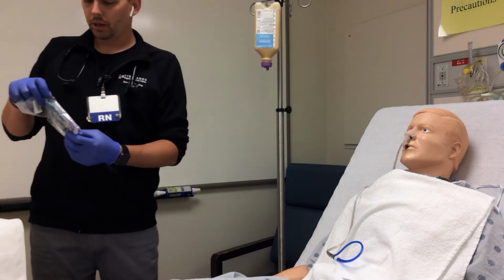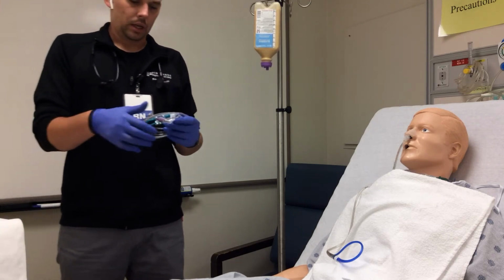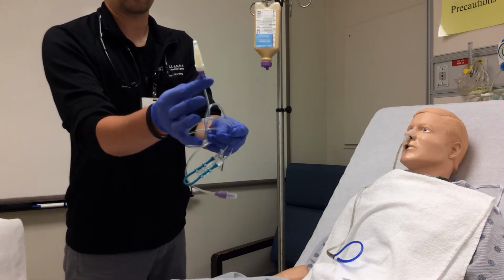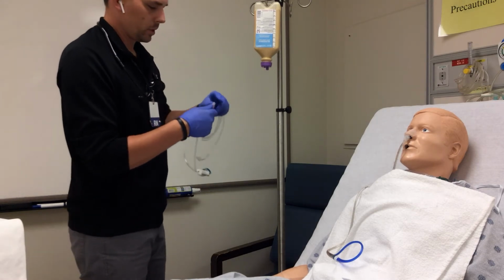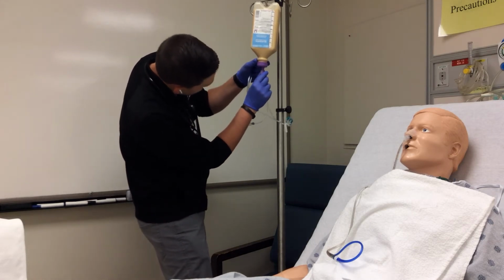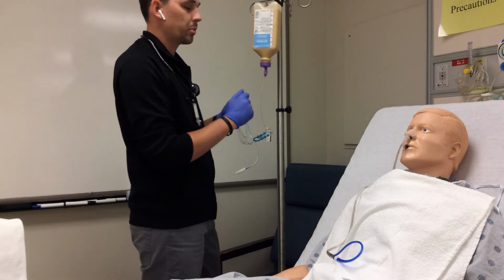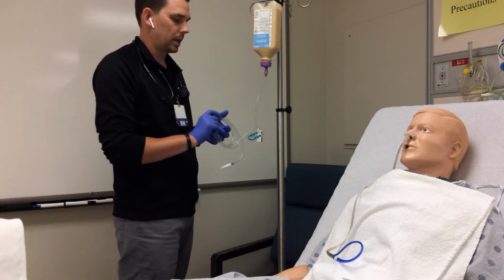Next, you're going to get our tubing. And you'll notice we have a purple spike that we are going to connect to our tube feed bottle, and then we have our opening that's going to connect to our NG tube. So what I'm going to do is take my spike, get it into the bottle, and twist until I feel a click. Once it's clicked, then I know that I have spiked that bottle appropriately, and now I want to leave this connected, otherwise you might have a little bit of a mess on your hands.